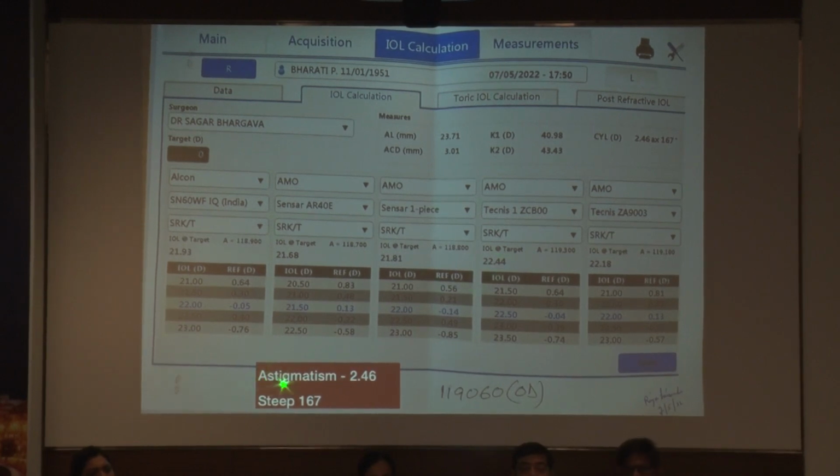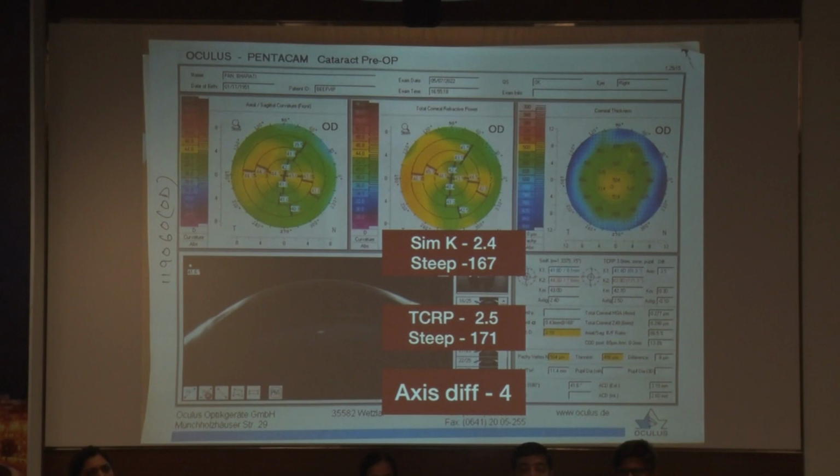This was a patient who has astigmatism of 2.46, steep axis at 167. This is Aladdin. We did a Pentacam, so you can see that the Pentacam SimK is 2.4 at 167. TCRP gives me 2.5 at 171. So the difference was only 0.1. That means the posterior corneal astigmatism has not produced much effect on the overall result. The axis difference was only 4, so this is a very ideal scenario.